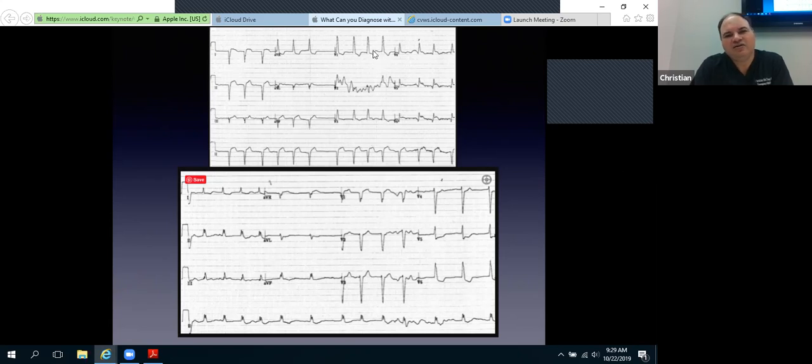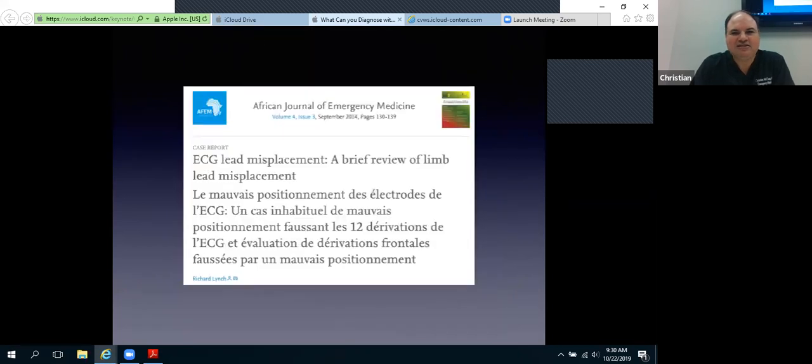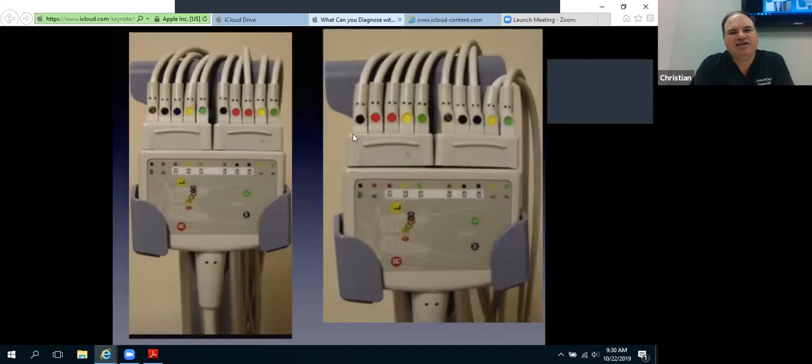And then you'll see here in the precordial leads that you don't actually see a progression of the R waves like you should. You generally should see S waves in V1 progressing to R waves in V3, V4, getting bigger by V5 and V6. And that whole pattern's messed up. Whereas you see that restored now with the repeat EKG.